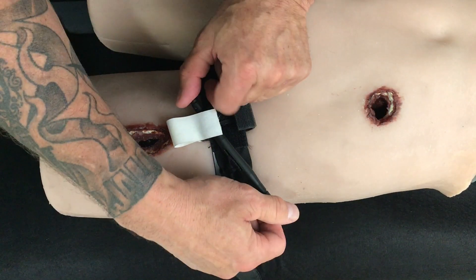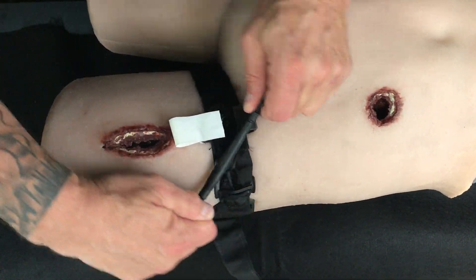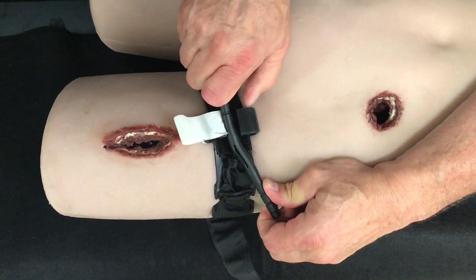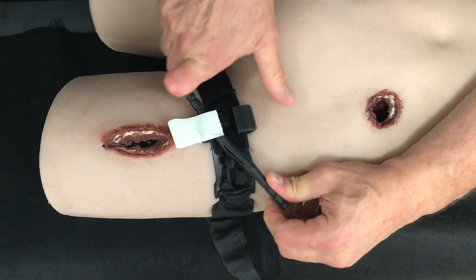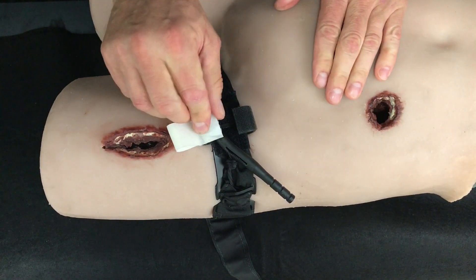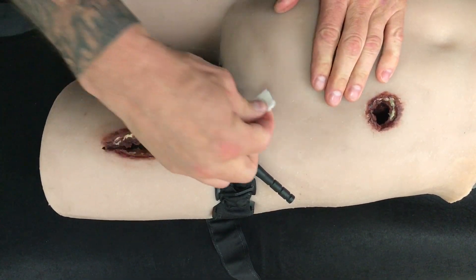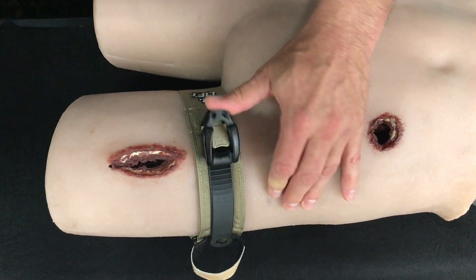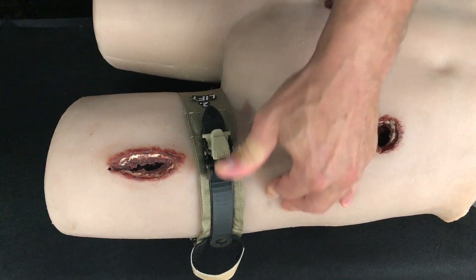If re-bleeding occurs on the limb, a windlass rod must be rotated 180 degrees and re-secured in its clip. This can cause tremendous pain to the casualty, as well as potential tissue and nerve damage from over-tightening. The TX2 has the capability to incrementally tighten by lifting the lever arm just one click at a time.